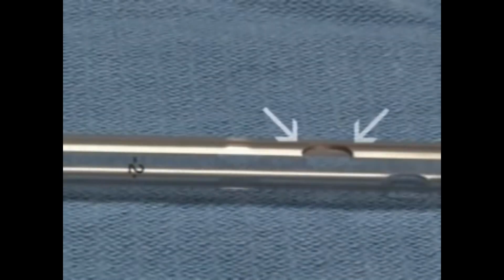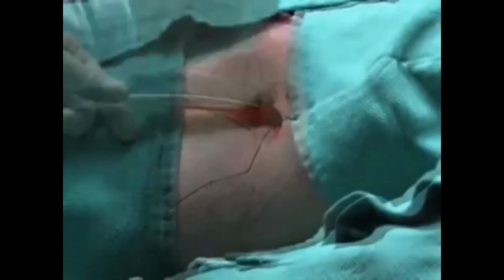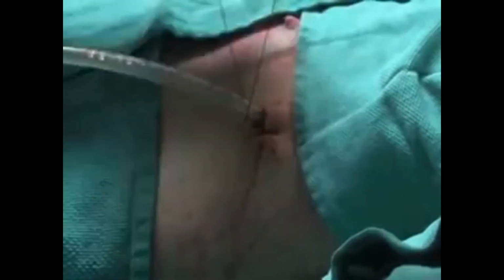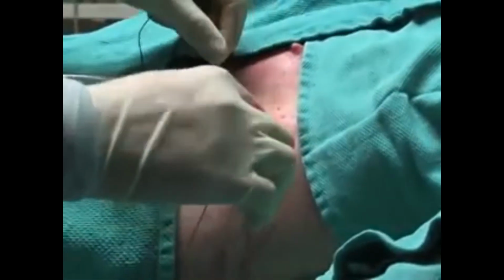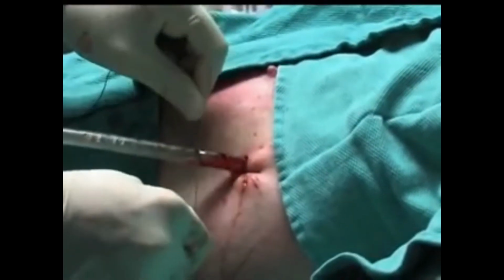Simple interrupted or mattress sutures are often satisfactory to ensure the stability of the tube and avoid air leak around the tube. The free ends of the sutures are wrapped around the tube and tied multiple times to secure it in place.